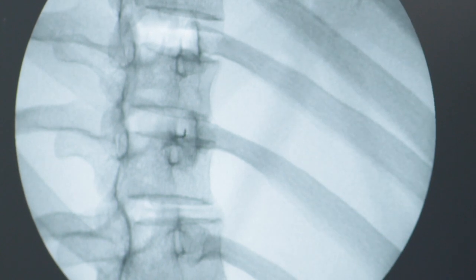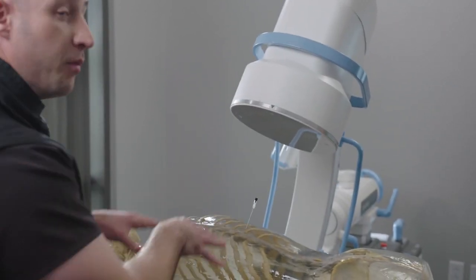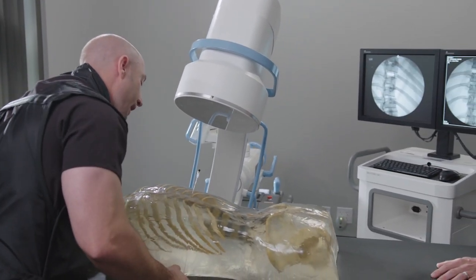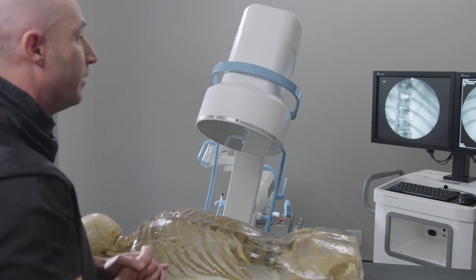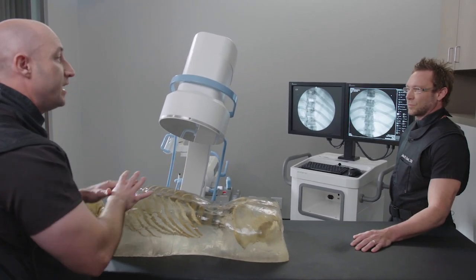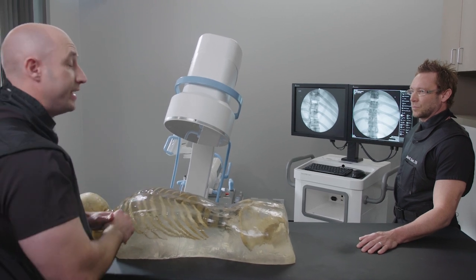All right, so my needle appears to be in position on my screen. You can see on the model where your needle is as well. So you can actually look over the needle. You can see how deep am I? Where's my lung? Where's my rib? And that can really help you get comfortable with what your anatomy is. You can't see it on a person, but you can definitely see it here.